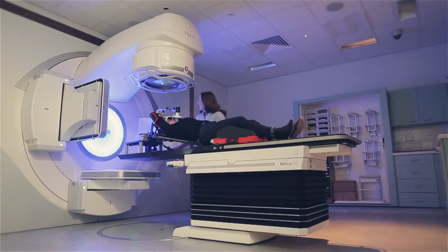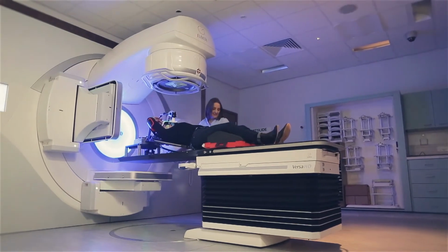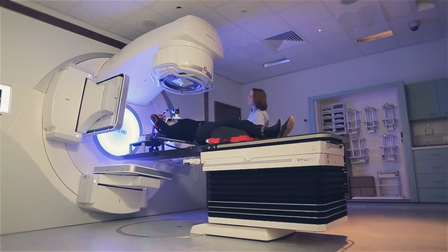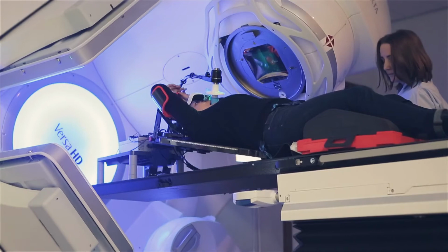At Cancer Partners UK, we are using a breath hold technique, which is used primarily for left-sided breast cancer patients. The technique is simple and easy for the patient to use. The patient is in control of the system at all times. At no point are they forced to hold their breath.